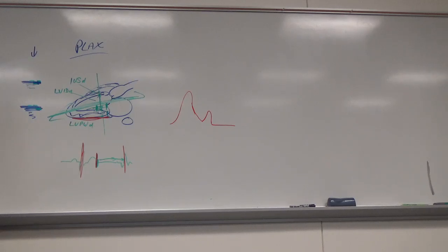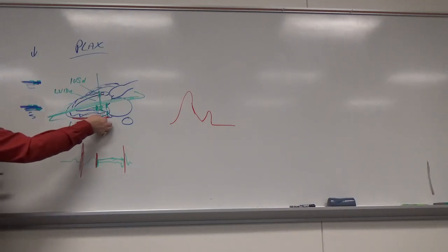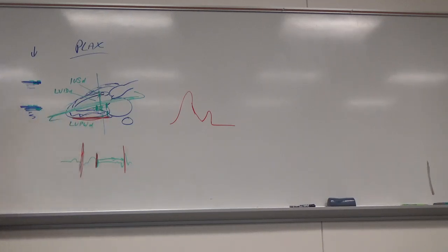It's going to be more of a hypoechoic type of appearance, but you'll see a little bit brighter line at the fluid side, and then on the back side you'll see a bit of a line, and then you could see a bit of a space between this, and then you're going to see a thick white line beyond that. That's the pericardium. Never measure into the pericardium because then you're past the heart. So, left ventricular posterior wall, diastole. This is left ventricular posterior wall, diastole.